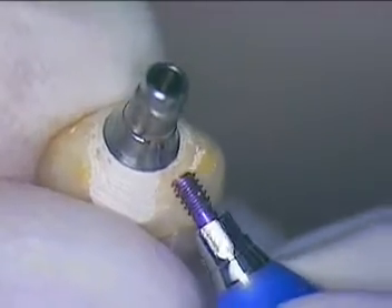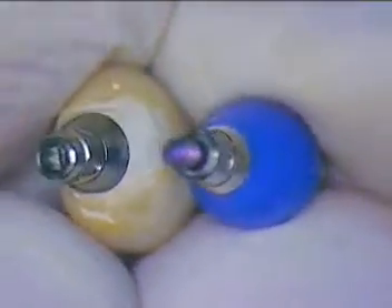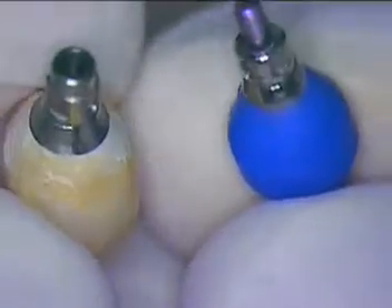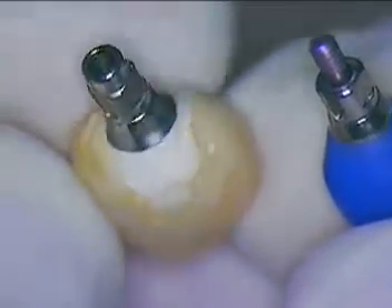We're basically interested in the immediate emergence profile as it comes from the soft tissue. So if we compare the two — we're interested basically from right around here up — and we know that this is out too far to the labial. So we'll capture our impression and we'll also reinsert this impression coping back in the impression to show you how easy that's done. And then we'll put our temporary back in one more time.